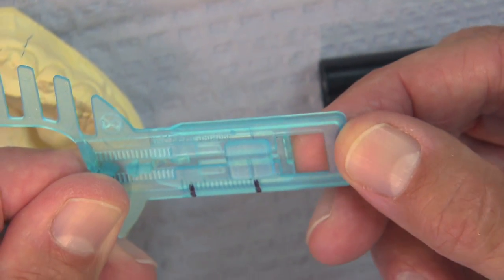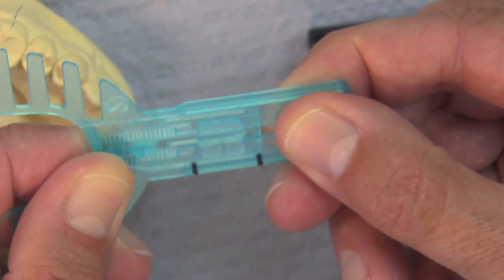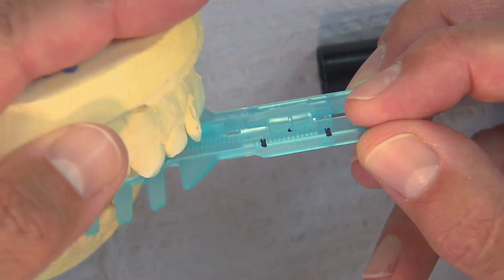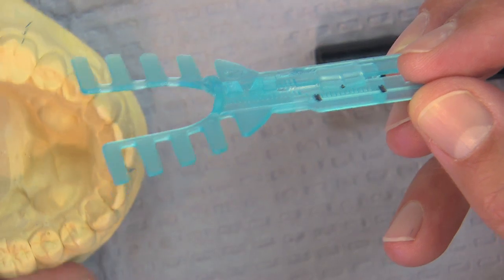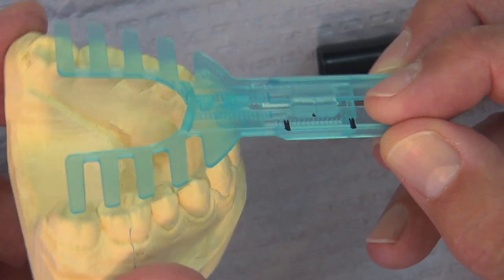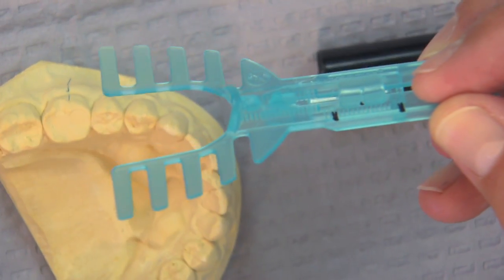So you'll see I slide this gauge back so it's halfway between those two marks, and then we'll put this into the patient's mouth again, and we'll line up 8 and 9 in the upper notch, and then we'll have the patient bite, move their jaw slightly forward until their 24 and 25 are in the lower notch, and then with their teeth together, we're going to inject some bite registration material around the two forks in the back.